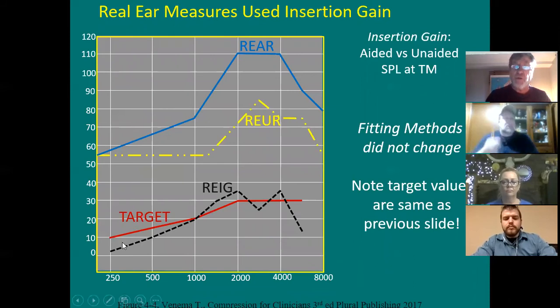The target derived here was found on the computer. You'd enter the hearing loss into the computer, and then you'd choose NAL-R, and all of a sudden, boop, the target would pop up. Or you could enter the hearing loss into the computer and choose Berger, and a Berger target for that particular loss would pop up. Everybody fairly clear on what we've talked about today that way?